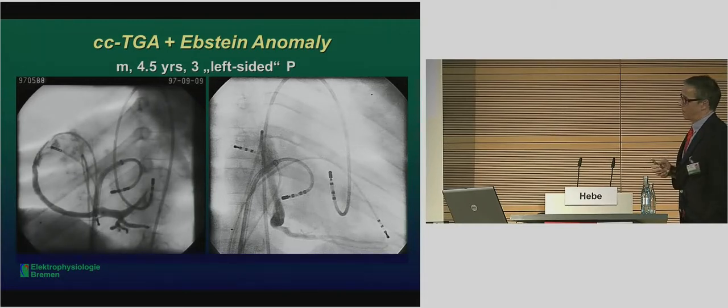And what you need to know is that when we go to the left side of the heart to map accessory pathways, to find left-sided accessory pathways, and we are maybe dealing with multiple accessory pathways, we need the coronary sinus to access from the transvenous route, to have a stable catheter position within this coronary sinus. So we always aim to find a way here.